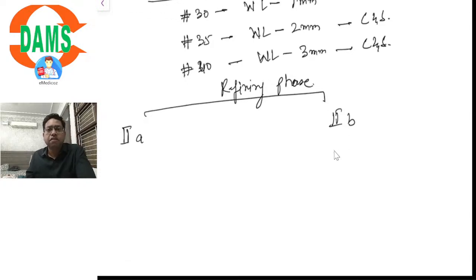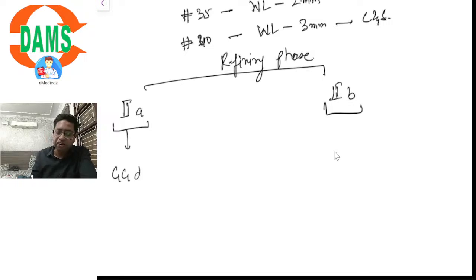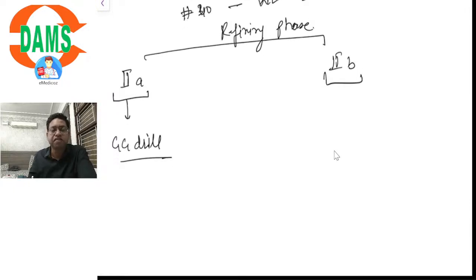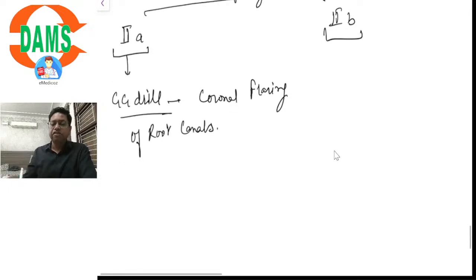Refining phase. What is phase 1? Apical preparation. What is phase 2? The phase 2 is step back, and the phase 3, instead of calling it 3, we call it refining phase 2A and 2B. In 2A, what is done? GG drill. All of you must be knowing what is GG drill. We have already discussed GG drill in one of the previous sessions. GG drill is used for coronal flaring of the root canals.